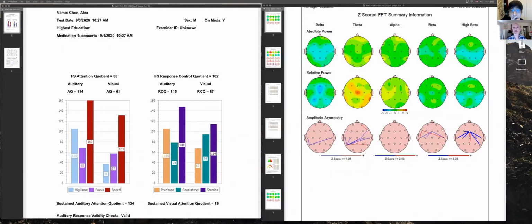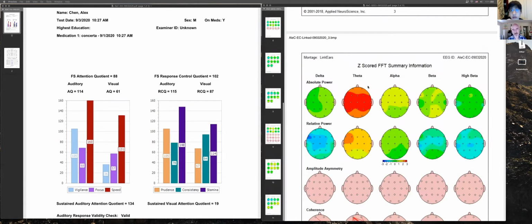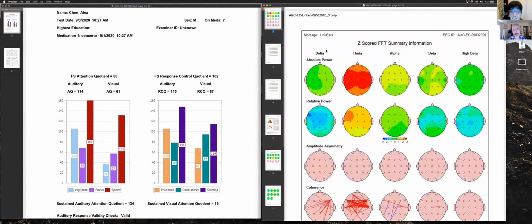Well, I have a lot of power at theta. A little bit you do, yeah. With eyes closed, which isn't actually always a big deal. And then here's eyes open, where it's not very much at all. It's okay. So don't be thrown by the unusual things until we give you some context, right? But yeah, it's a lot with your eyes closed.